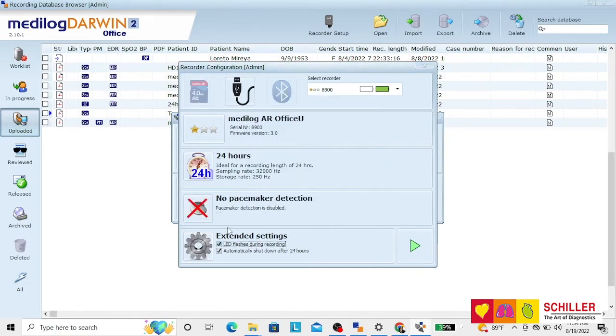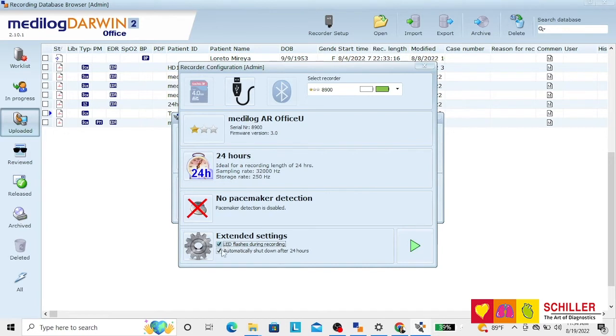In extended settings you can opt to have the LED light on the recorder flashing during recording and to automatically shut down the recorder after the elapsed time.